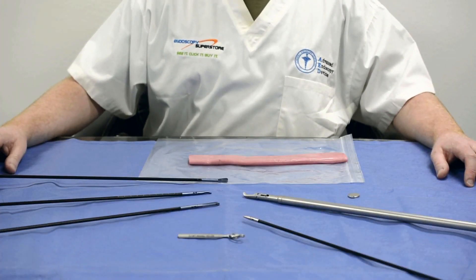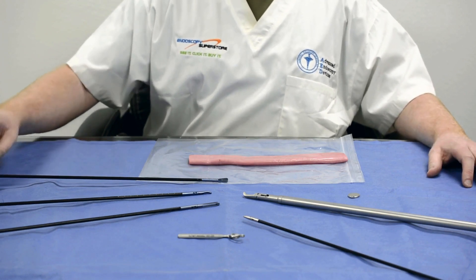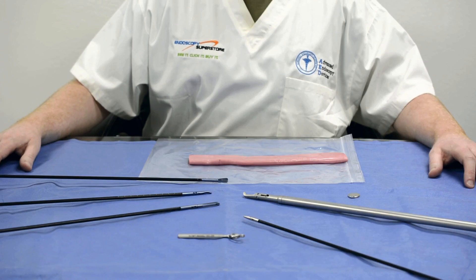Welcome to Endoscopy Superstore. I'll be sharing with you our line of non-magnetic laparoscopic forceps. These forceps were developed for the purpose of manipulating rare earth magnets used in laparoscopic surgery, specifically for magnetic anastomosis.